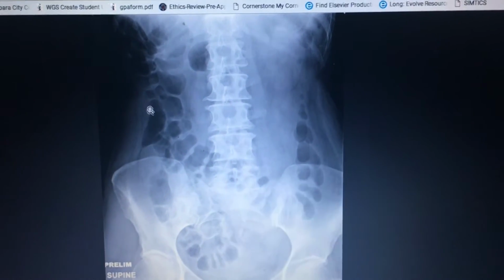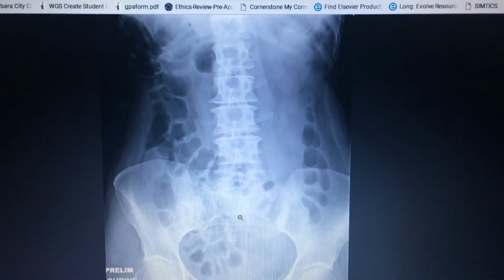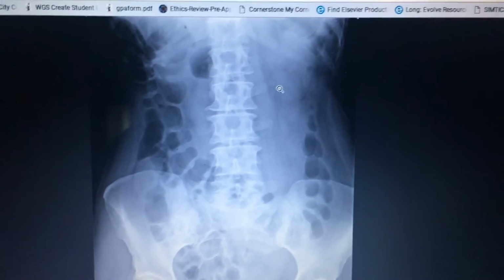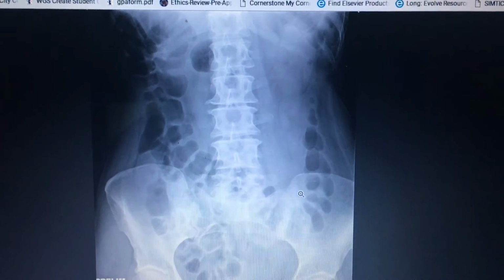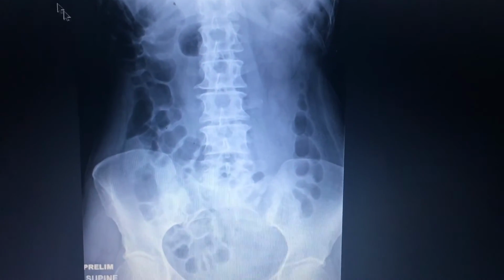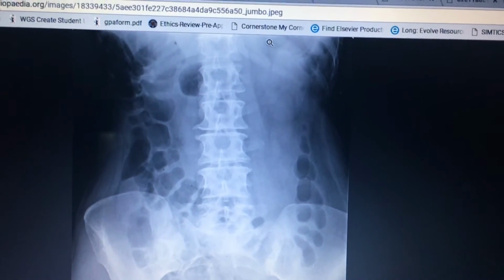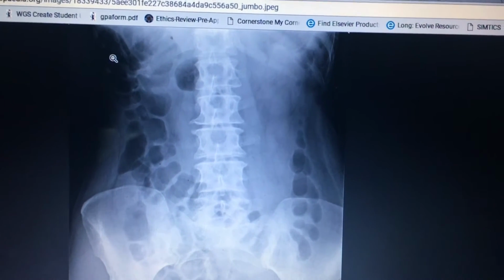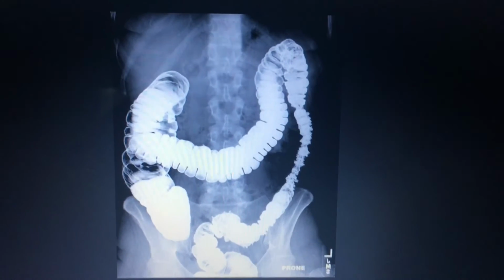As you can see here, you can see a lot of gas in the bowel. That's what we want to see. That'll make sure that there's no obstruction that we can see, and that should allow a smooth flow of barium. You got the pubic symphysis. Can't see the diaphragm, but you can see the left colic flexure and the right one, so we're good to go. On to the next image.